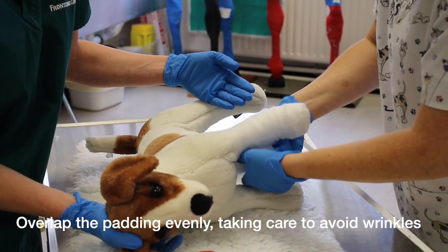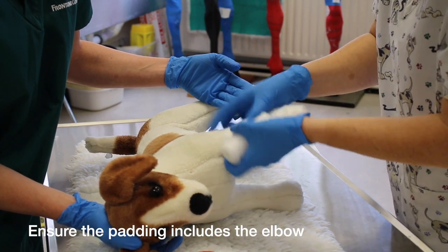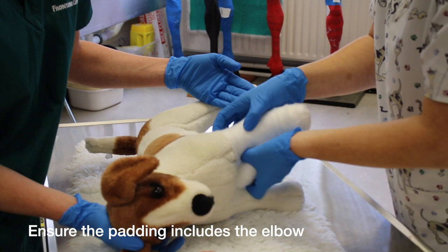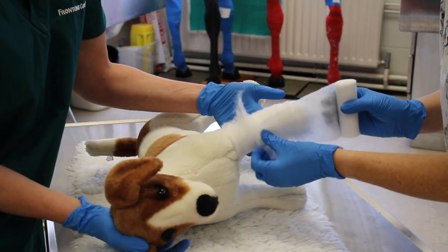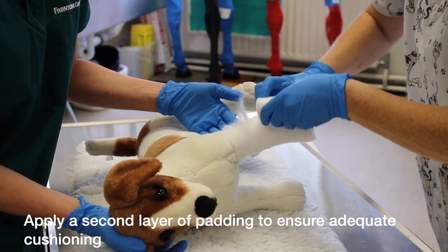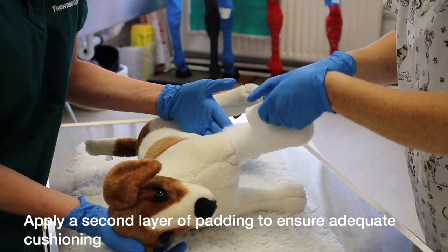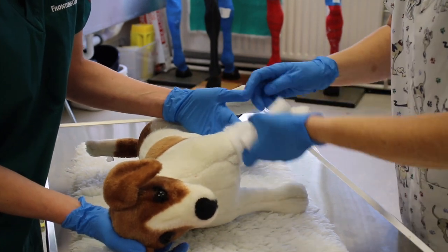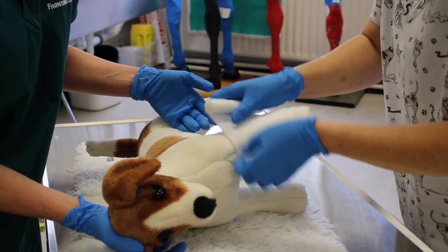Make sure you go right up and cover your elbow, because you don't want the splint to stick into the back. So again, start at your foot, work over and up by 50%. Keep your tension even.